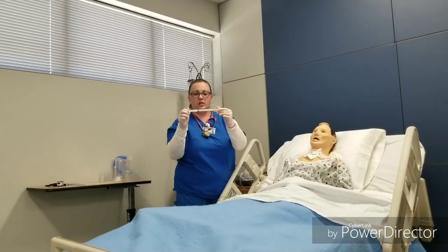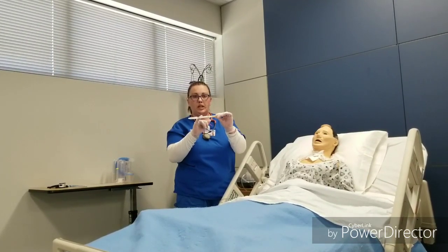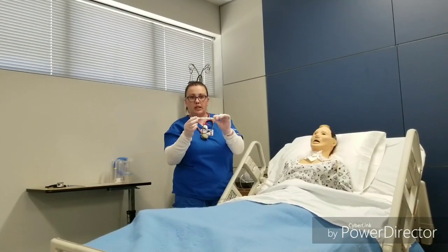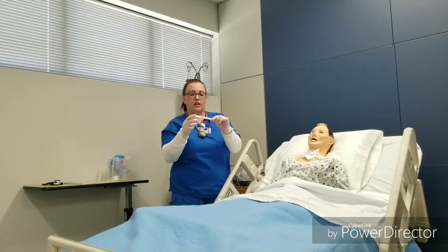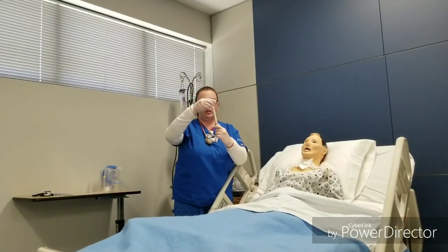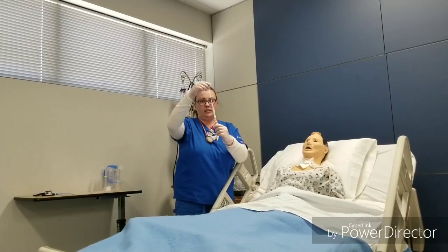And this is your throat culture swab, and it will have a label on it. If not, you may already have a label printed in the patient's chart. Just pull one of those off and place it on here, and then you want to initial and time that label. When you open this, you want to make sure not to touch the end of the swab to anything.